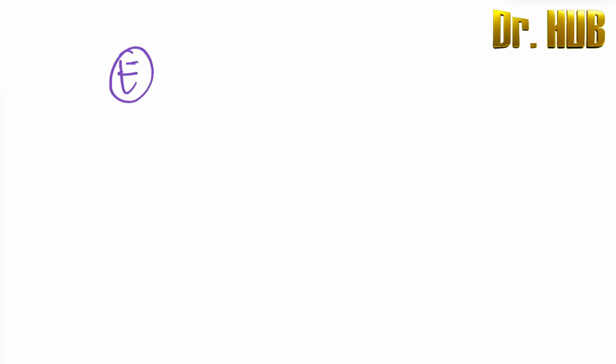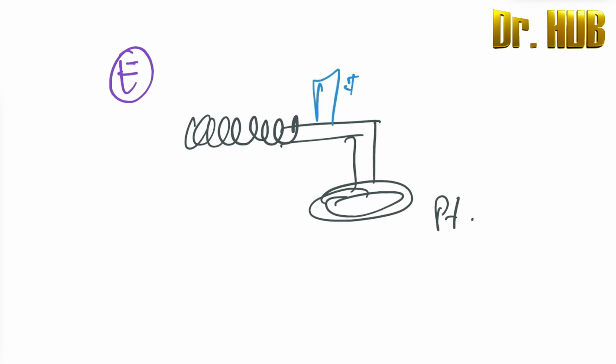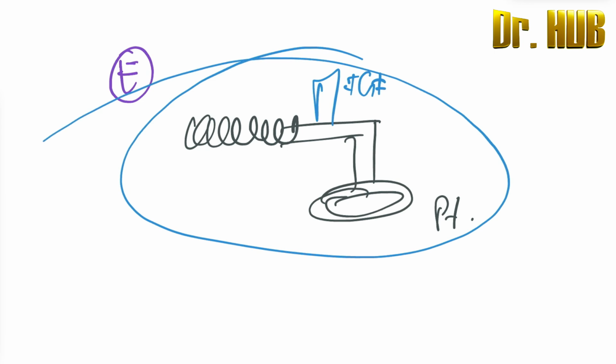So how is the Mapleson circuit E? In Mapleson circuit E, there is going to be the corrugated tube, and then again the patient's end. Right next to the corrugated tube towards the patient there is the FGF. And in the E Mapleson circuit, there is no reservoir bag. This is very important to note.